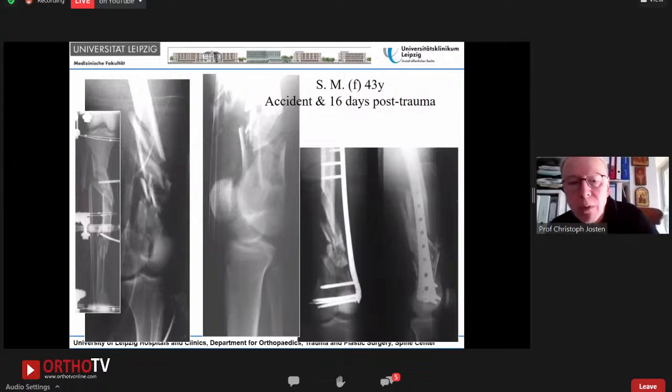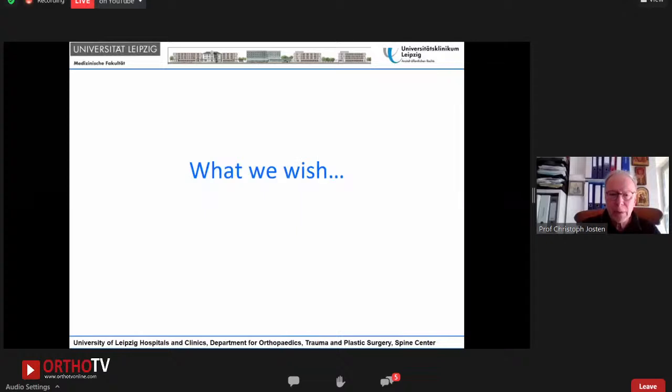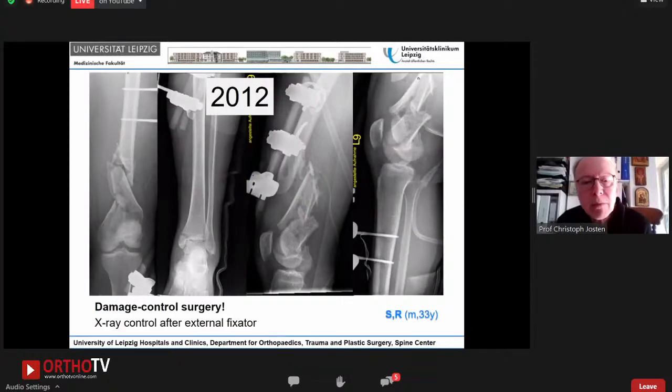This is a case we did 10 years ago, an accident in a polytrauma patient with a C3 type fracture, or C2 or C1 type fracture, which has also been treated very simply with an angle-stable plate, and 1 year later, a good healing. No additional medial plating in a C1 complex fracture.